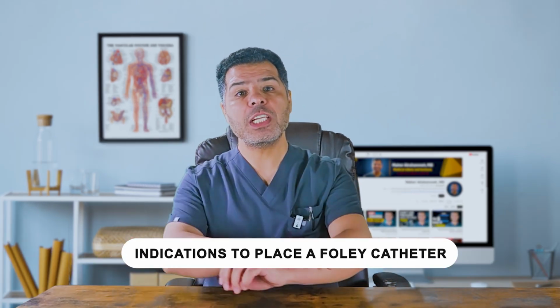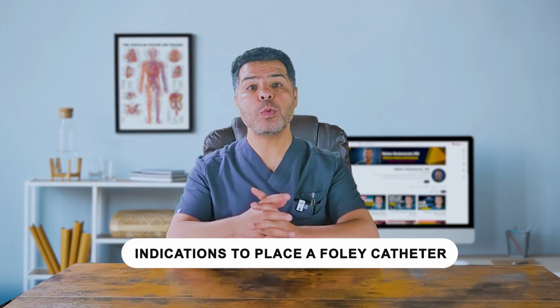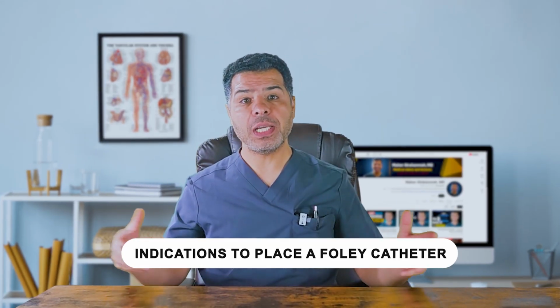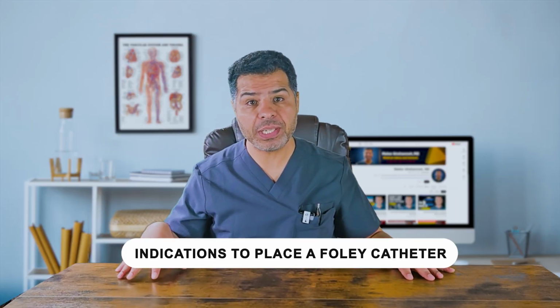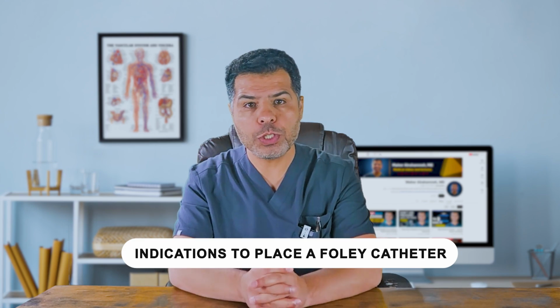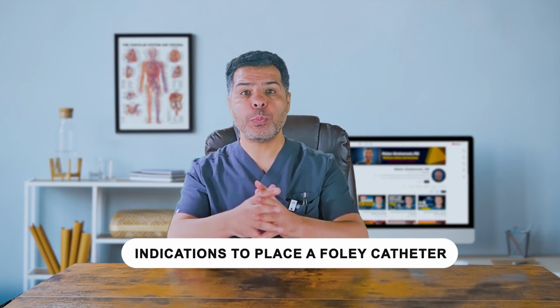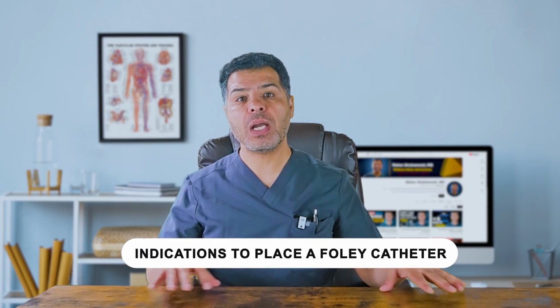Of course, there are some indications when non-invasive urinary catheters are not helpful and Foley catheters have to be placed. These include the following: acute urinary retention or bladder outlet obstruction that cannot be managed otherwise. Accurate hourly urine output monitoring in critically ill patients, like patients with shock, acute kidney injury, or major surgeries. Again, we talk about critically ill patients. Perioperative use for specific surgeries, particularly urologic or prolonged procedures. And comfort care in end-of-life situations when moving the patients for toileting would cause distress. And to assist healing of open sacral or perineal wounds in incontinent patients. And finally, prolonged immobilization due to unstable spine or pelvic fractures.